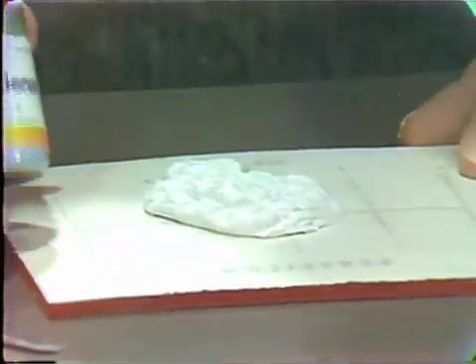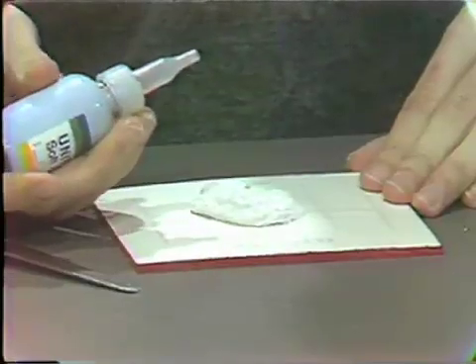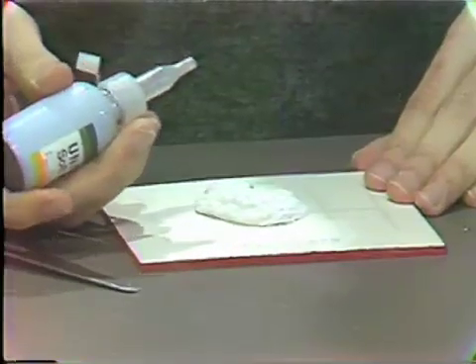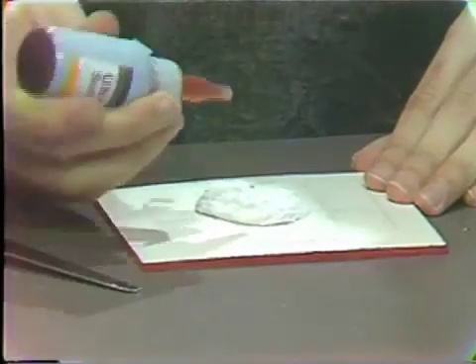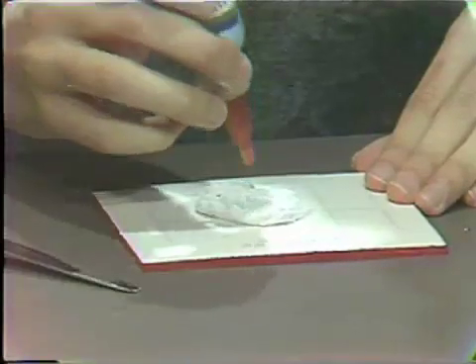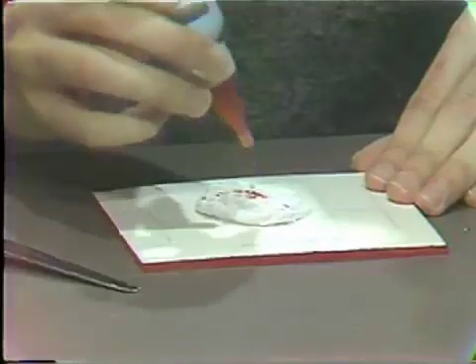The liquid hardener can be dispensed in eight to ten drops. The more drops that are dispensed, the quicker will be the set of the material. On this mix we'll use eight drops: one, two, three, four, five, six, seven, eight.